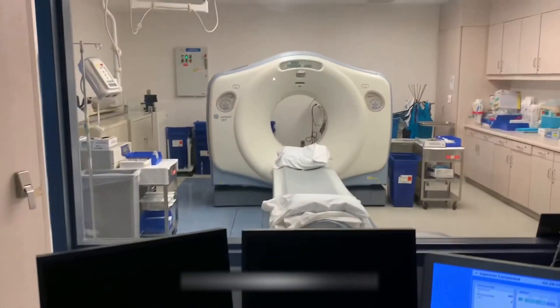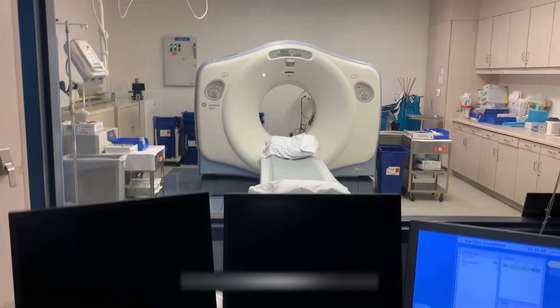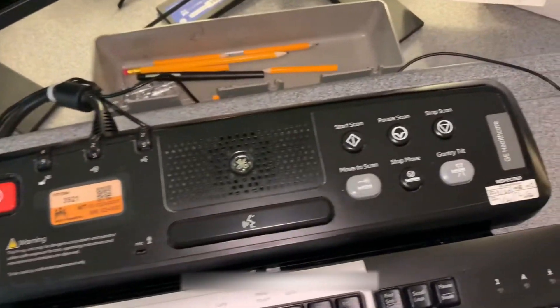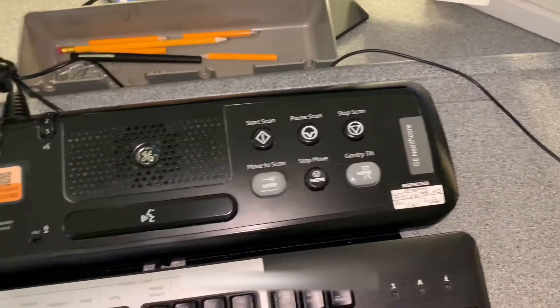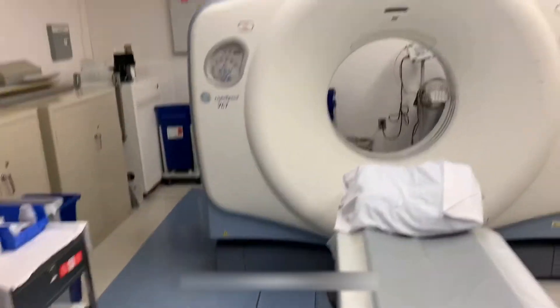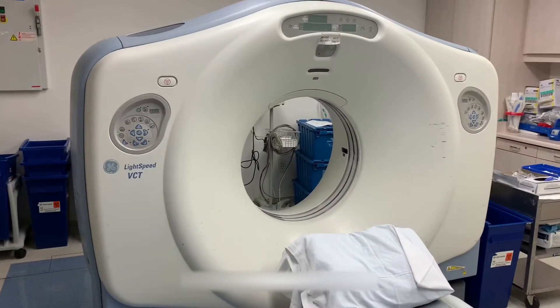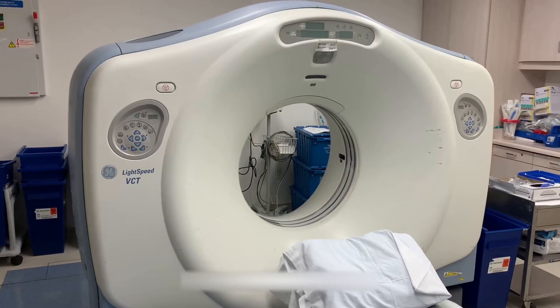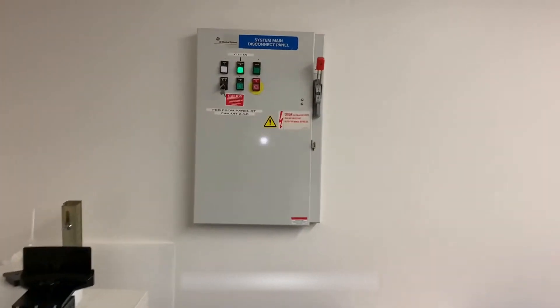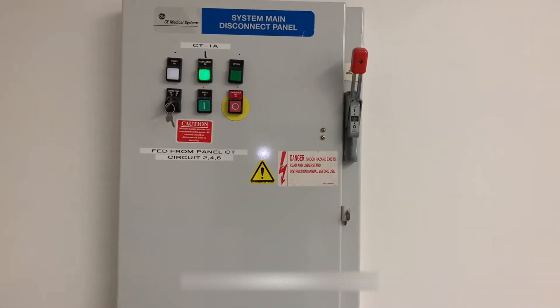Here we have a GE Lightspeed VCT with no visible indication of power in the gantry or the operator console. Check your A1 main disconnect panel for any power indications. Make sure your knife switch is in the upright position and press the start button.